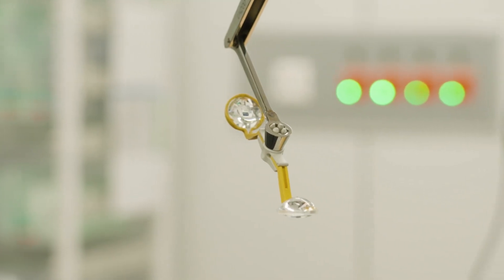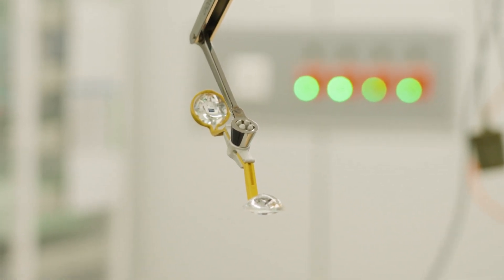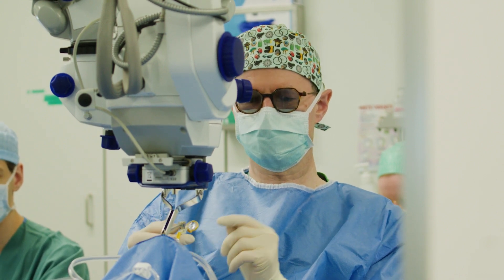The disposable lens is made out of PMMA, while the old one is made of glass. And you will see that it condenses a lot less than the glass lens.